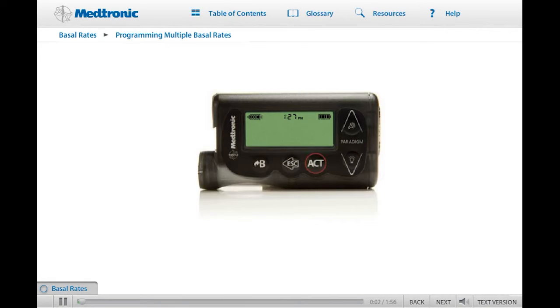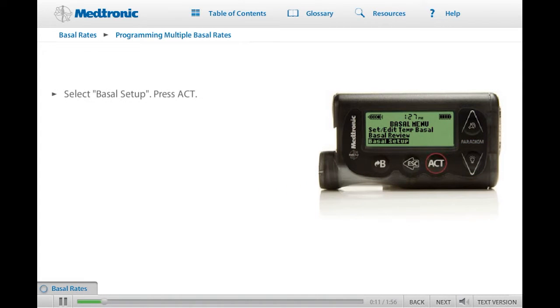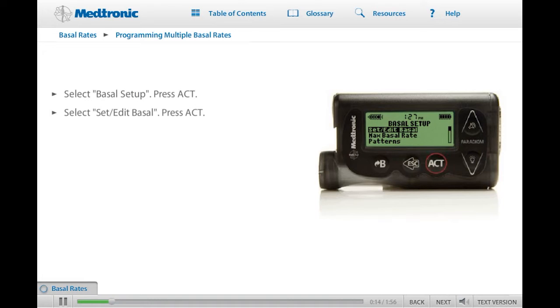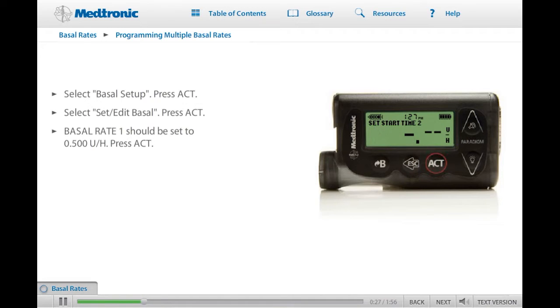Now that you are familiar with programming a single basal rate, let's try programming more than one basal rate. From the basal menu, scroll to Basal Setup and press ACT. Set Edit Basal should be highlighted. Press ACT to select. Set Basal Rate 1 appears — set the first basal rate to 0.500 units. Set Start Time 2 will appear with dashes flashing in the upper left corner, indicating that the start time for the second basal rate needs to be programmed. Set the following start times and basal rates using the up and down arrows, and press ACT to confirm each start time and rate as you set it.